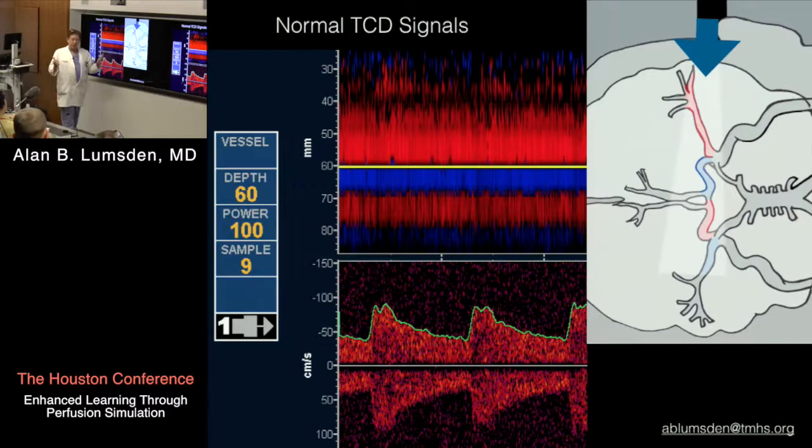So one of the things I'm talking about is, wouldn't it be nice to know what your pre-pump flow velocities are in your middle cerebral artery? I would like you to keep me around there. I will handle 80%. I may be able to tolerate 50%. I don't want to have my cerebral hemisphere flowing at 40% of the rate that I started at. So, and we don't know the answer to this. I mean, one of the questions could be, do we establish what the baseline velocities are, come up with a mean velocity and say, hey, you should be perfusing my brain to whatever it should be. I don't really know what those numbers actually are.